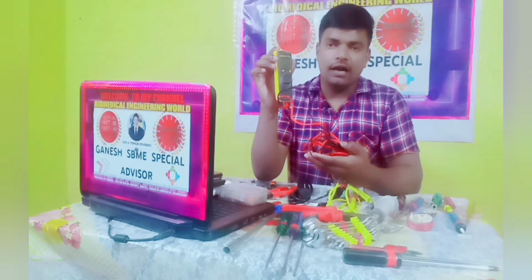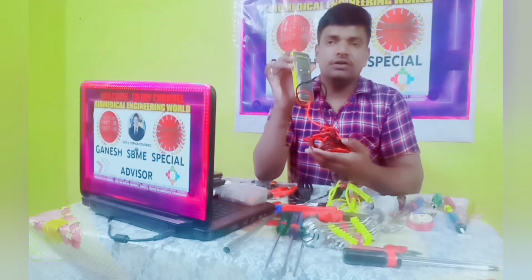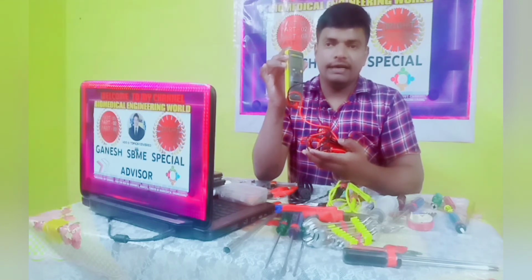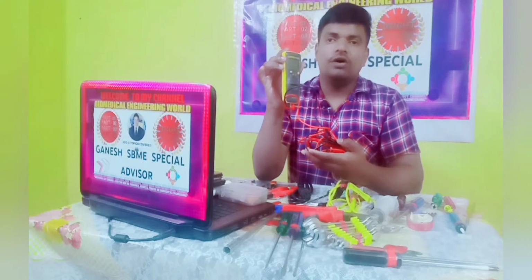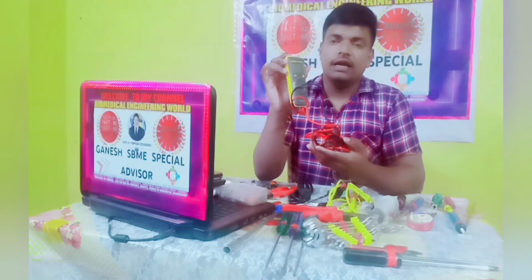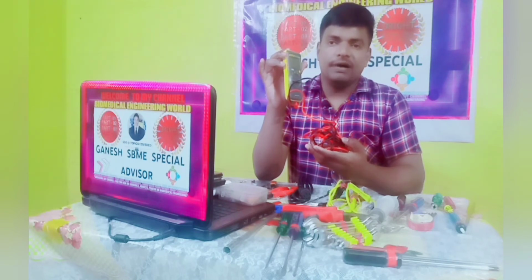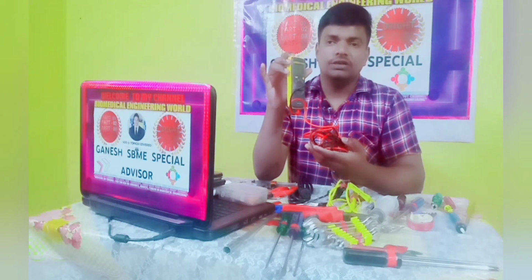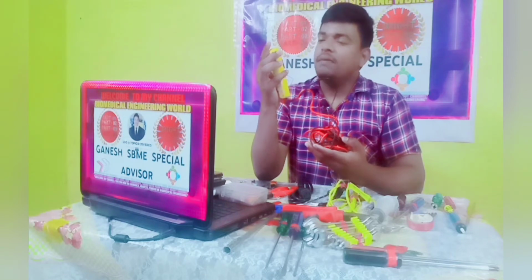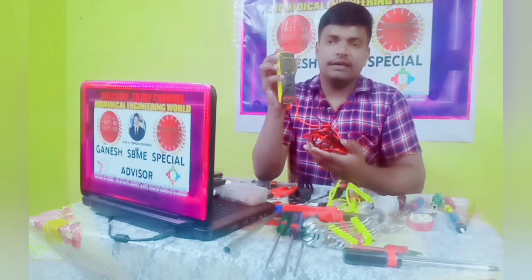Understand friends? This is the most essential toolkit, because wherever you go, first you have to check whether the power supply and connections are right or not. We need to verify that using this multimeter. This is the essential part in the service sector, in the workshop. In this multimeter many parameters and functions are available, and we can apply them in different ways in all situations.